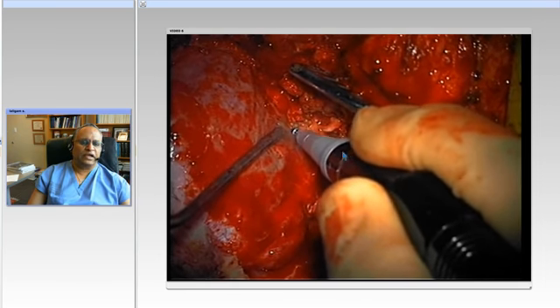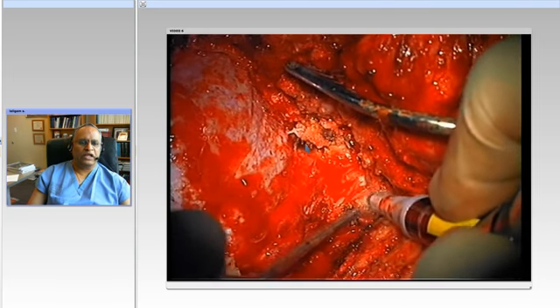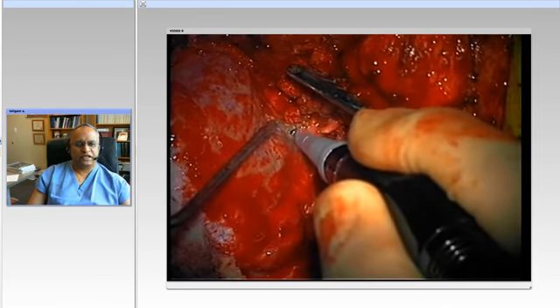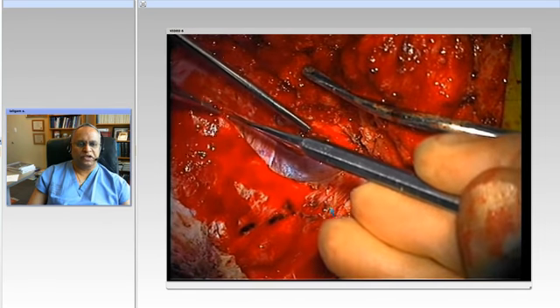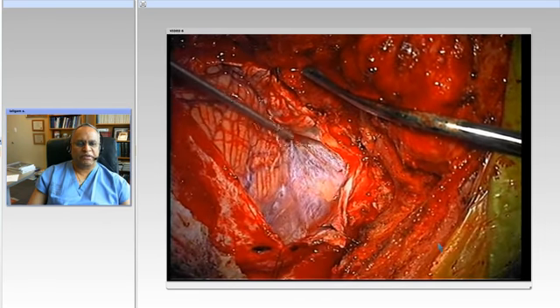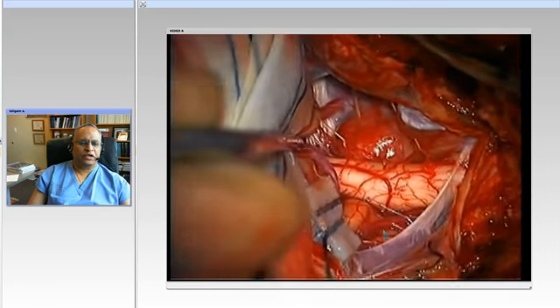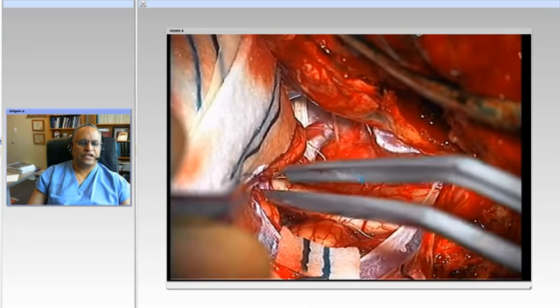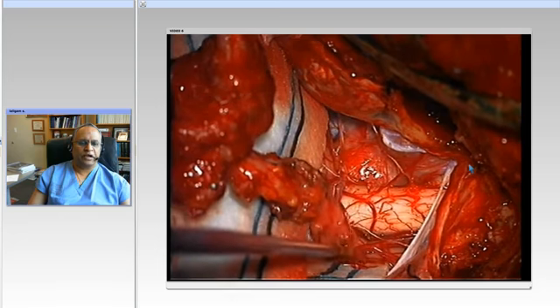Now we've done a suboccipital craniotomy. Foramen magnum has been unroofed, removing a little bit of the condyle just to give us a little more exposure. And that's a Sonopet bone curette. And we've also exposed the vertebral artery in the V3 segment, opening the dura mater. Here's the vertebral artery here. And here we see the intradural portion of the aneurysm. This is PICA coming out.